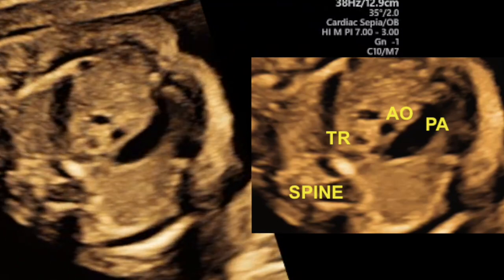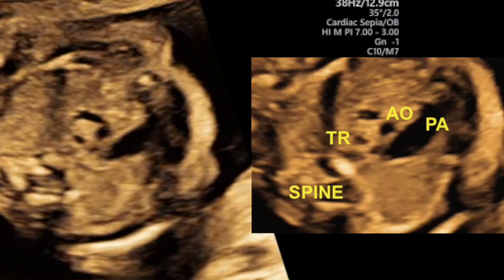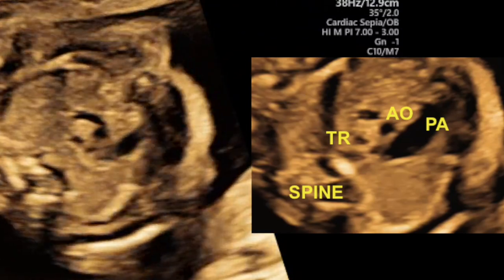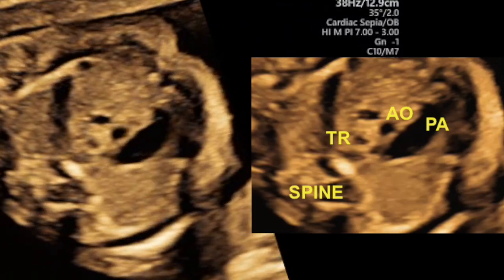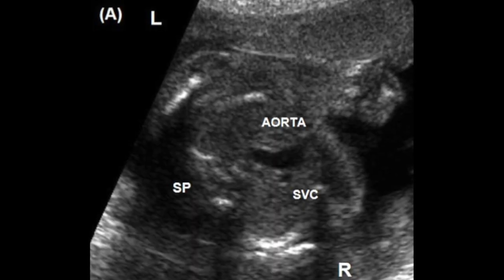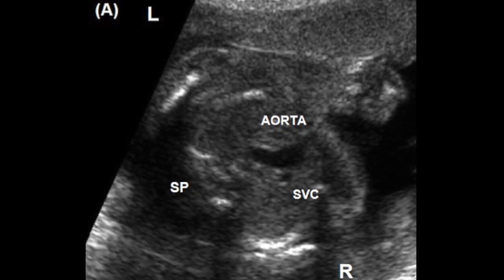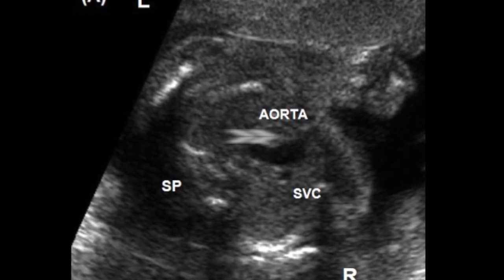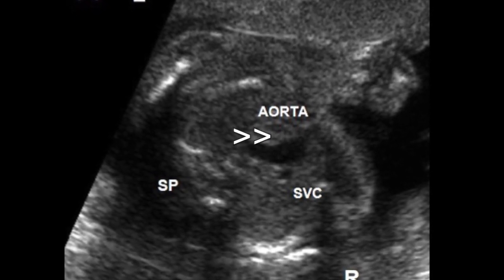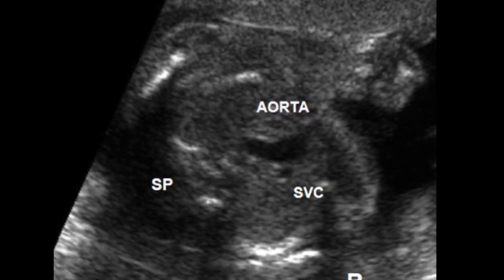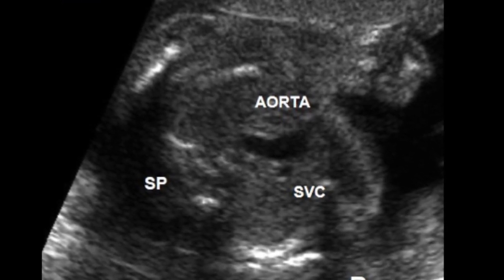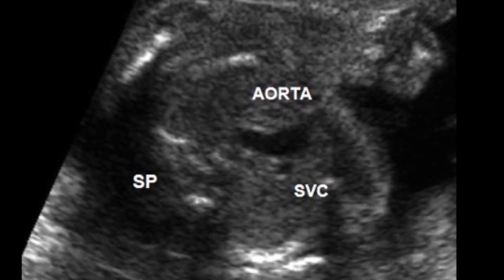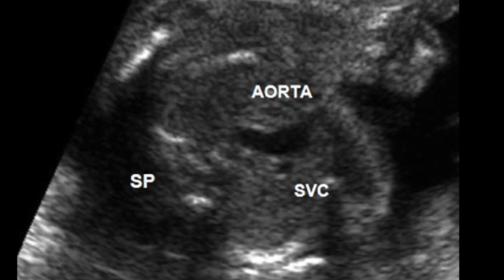This image shows the spine, SVC, aorta, pulmonary artery, and trachea, and here we can see that the aorta is small in size — an example of abnormal vessel size. In another patient, with the spine and right side visible, only two vessels are seen: the SVC and the aorta, and this aorta has an abnormal configuration — an oblique or curved shape. This tells you that something is wrong with the outflows and you should scan the outflow tract views more carefully.